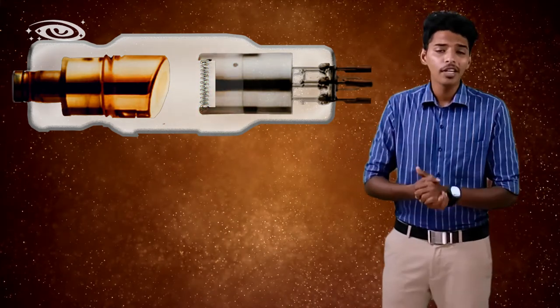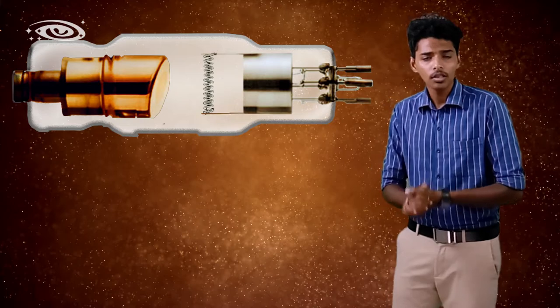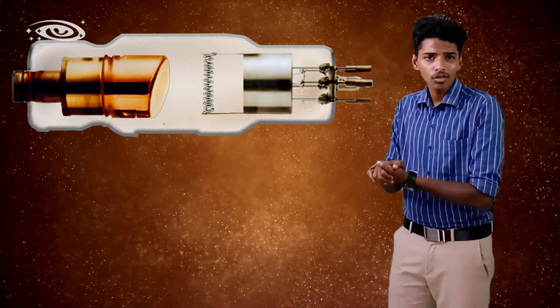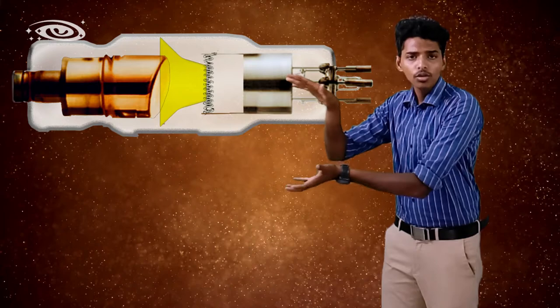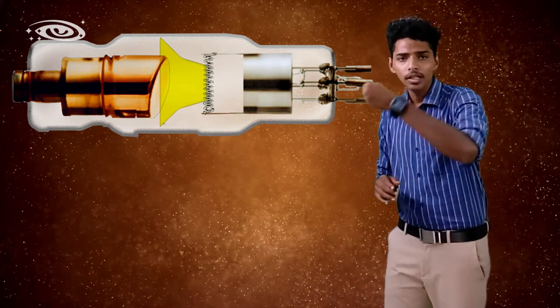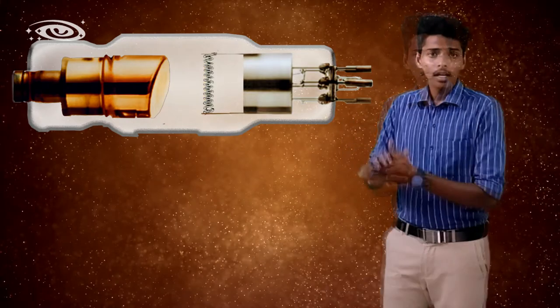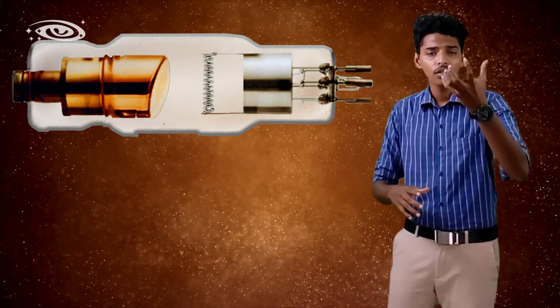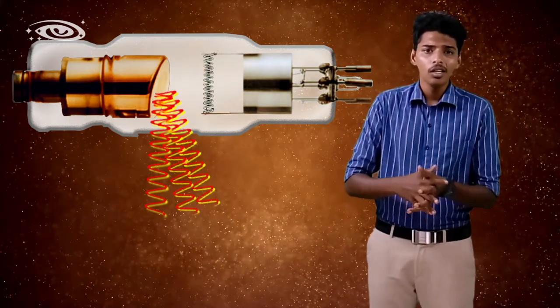For example, if there is no focusing cup, all the filament electrons will be diverged in all directions. Due to this divergency, not all electrons will interact with the anode, and the intensity of the x-rays will be reduced. Those x-rays are not used for the radiograph.